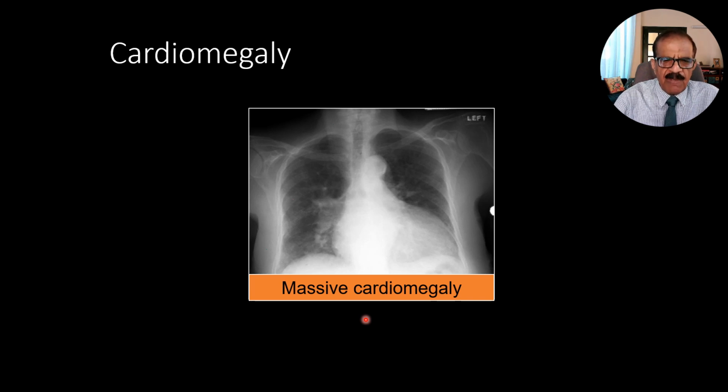But in the examination, you would be required to actually precisely measure it and demonstrate how to determine the size of the heart. Now, I'm going to demonstrate that now. First of all, you draw two lines. They are imaginary lines. You may actually draw the lines, but that will spoil the X-ray.